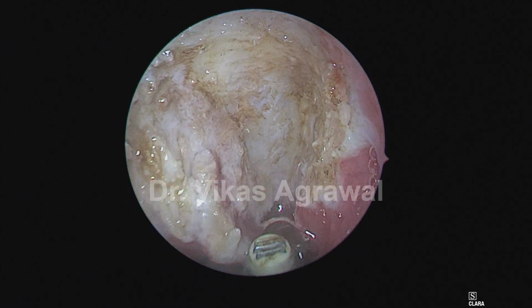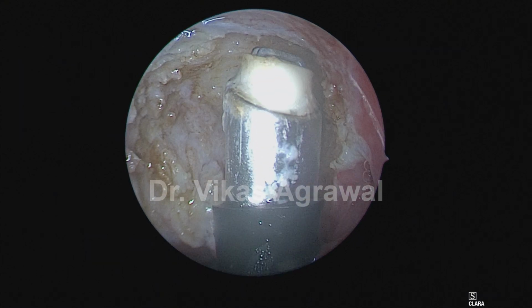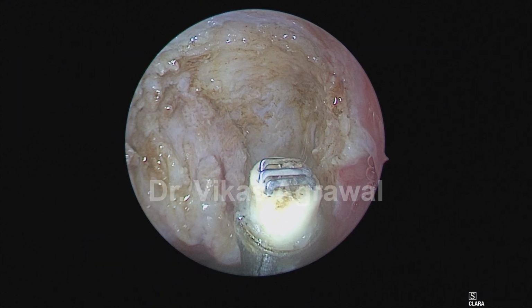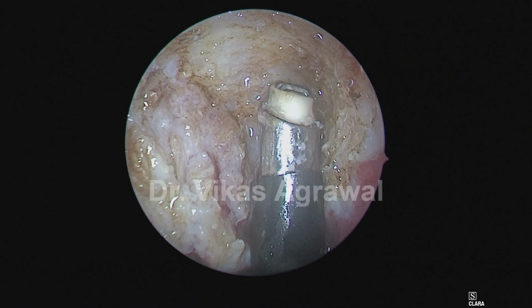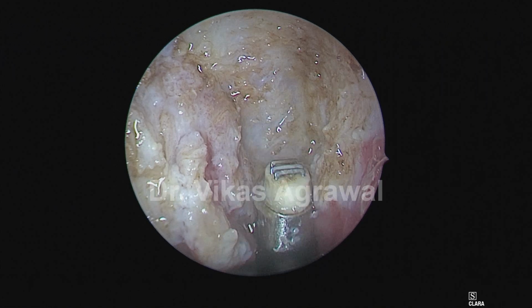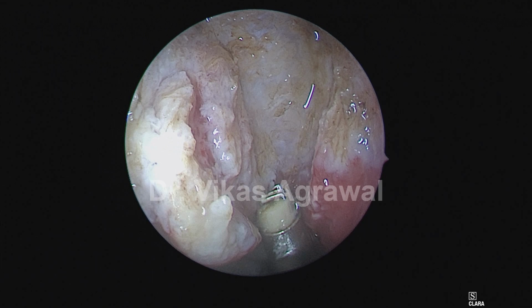Now you can see the boundaries of the adenoid surgery on the left side. That's the superior boundary, which is the periosteum below the sphenoid. Lateral anterior is the torus tubarius. Lateral posterior is the fossa of Rosenmuller. Behind is the buccopharyngeal fascia. Inferiorly is the Passavant's ridge. So left side is done.